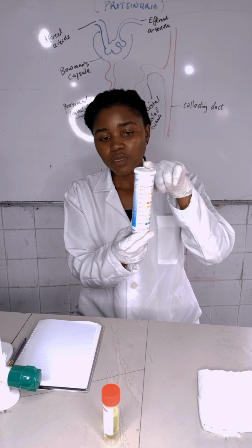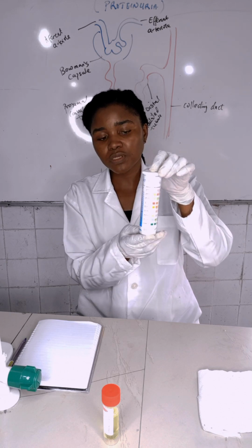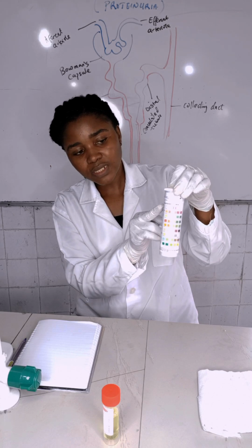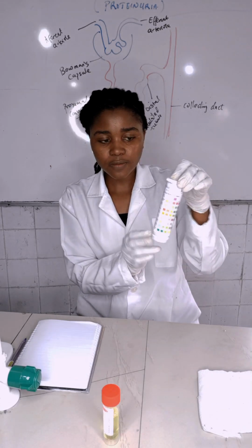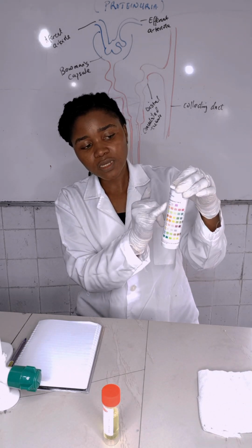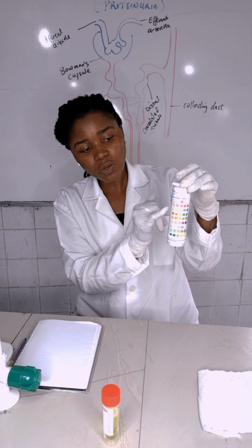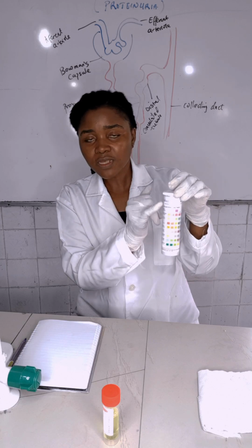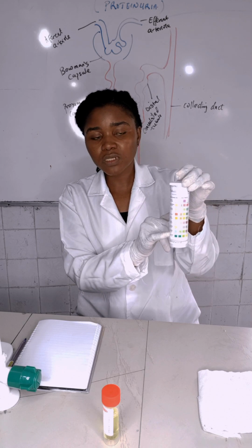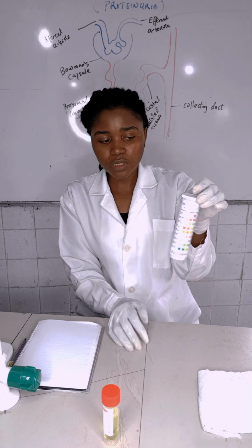This is the container. It comes with a chart, and this chart helps you to take your reading. These are the 9 parameters, starting with nitrite down to ascorbic acid. This particular company added seconds. Like the first one is 60, because they say test and reading time. 60 seconds, 60 seconds, 45 seconds. This gives you an idea of which one reacts first. In 45 seconds, you should be able to start reading these ones. So it's advisable to read from down to up. That's the way they arranged it.